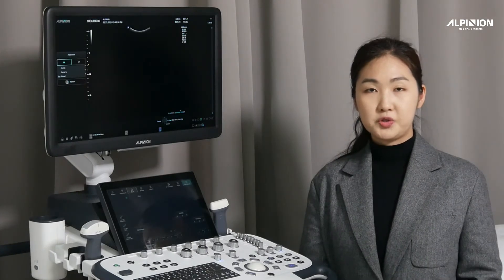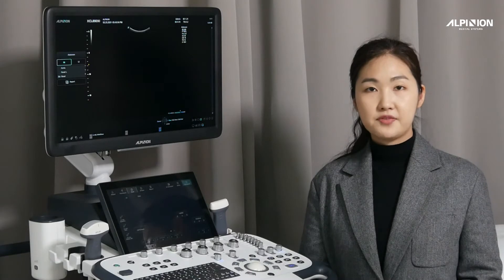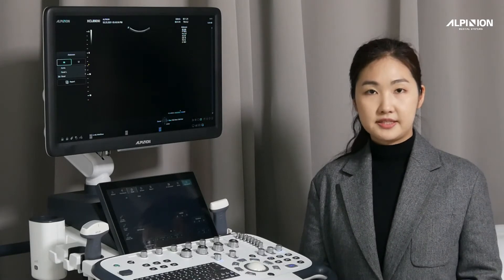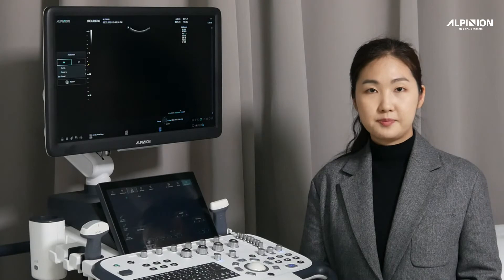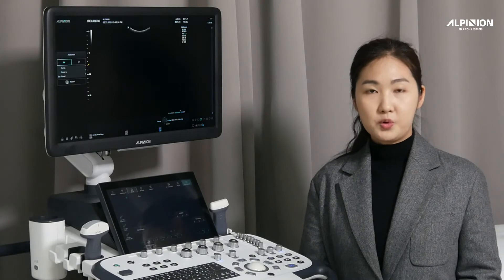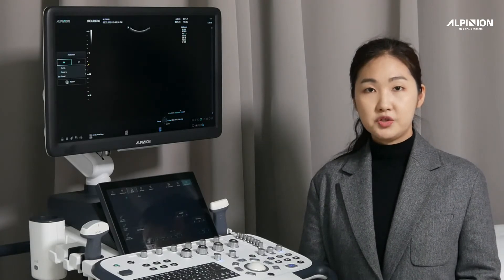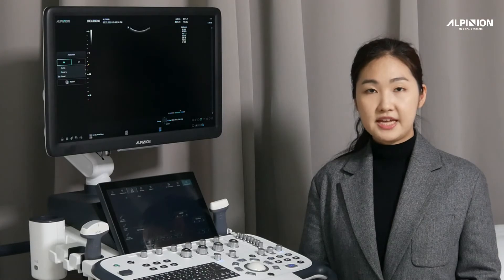Expo's micro-view shows a few more advantages. It features a fast frame rate but fewer flash artifacts due to breathing and transducer movements. Therefore, small vessels can be detected with excellent contrast, but without using a contrast agent.